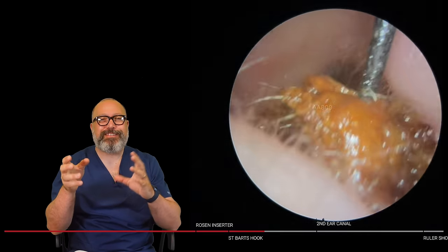So we're breaking this front end down here. It means we've got a little bit more room to maybe negotiate the next section around that bend. This is a bit of skin as well. My goodness me. This wax is just fighting you every inch of the way. Nothing wants to come out easily. There we go. Let's give that a bit of a wiggle. Out that comes. There we go. You can see that section gone there as well.